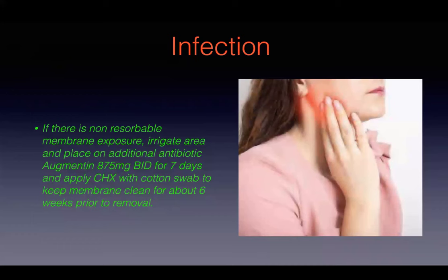So this is the 2 week post-op, still healing. I had made him an Essex for him to wear for about 3 months. I just saw him yesterday for about a 3 month evaluation, to see how everything is looking, and to get it ready for a temporary fixed bridge. That way we can begin shaping the papilla and sculpting the soft tissues and pontics.